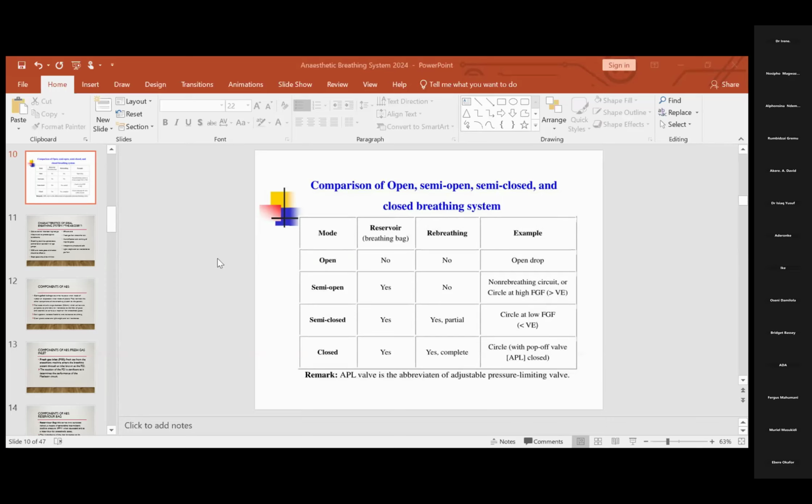Yes, sir. Yes, Prof. Okay. All right. So, okay, Dr. Nduka. Somebody quickly wrap up the different Mapleson A to F. Let me be sure that you got what I said from the little mnemonics that I gave you. Quickly, somebody wrap up class A to F. What are the differences? Dr. Nduka is your name that is showing very much here.